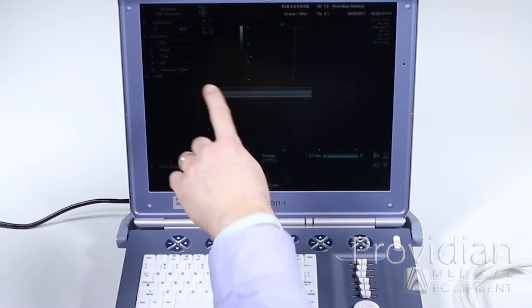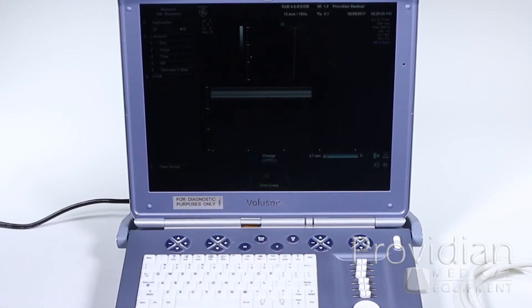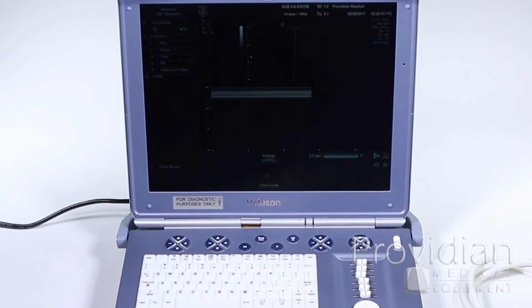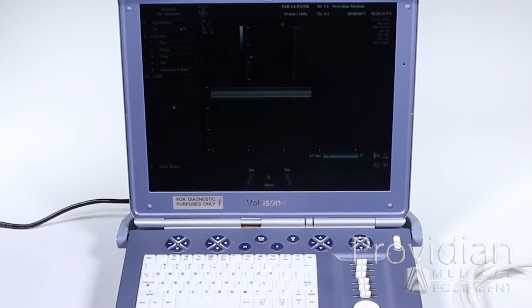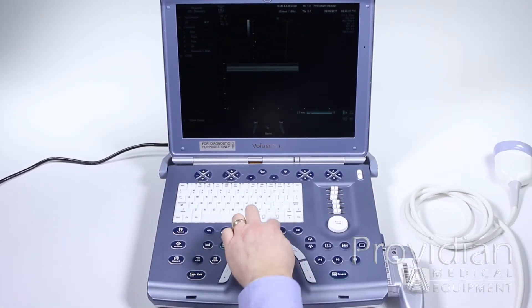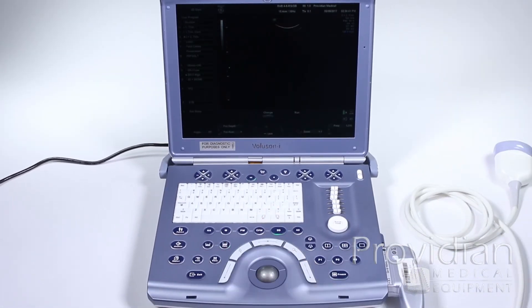You can also take measurements in M mode. Hit the calc button and go up to take your measurements. You can hit the arrow and select your measurement type — distance, slope, time, etc. Go back to 2D mode by pressing the 2D button.